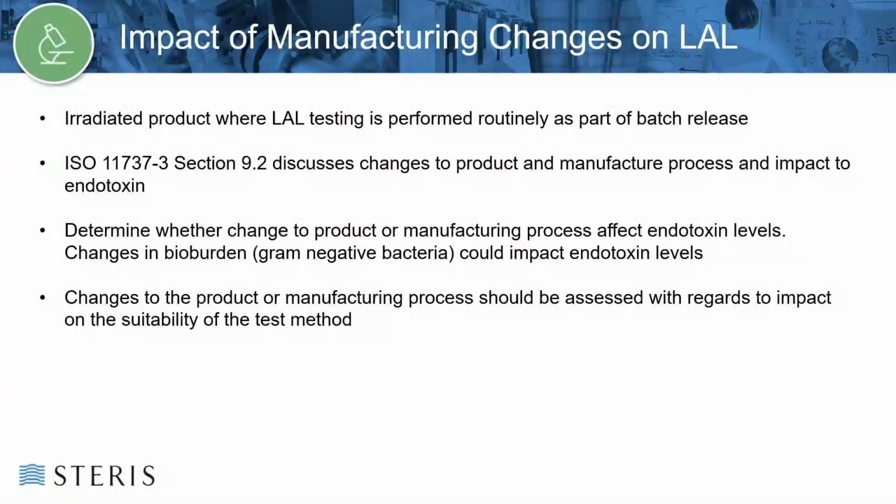While LAL is not part of the radiation validation process itself, it may be a test that is performed routinely as part of batch release when product is irradiated. If this is the case, changes to the product or manufacturing process should be assessed with regards to the impact on endotoxin levels and the suitability of the test method.